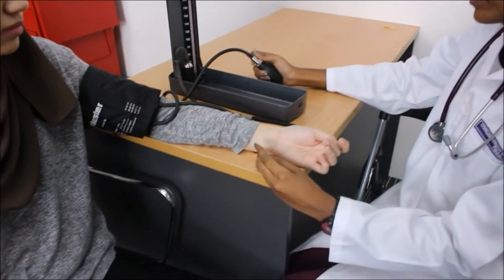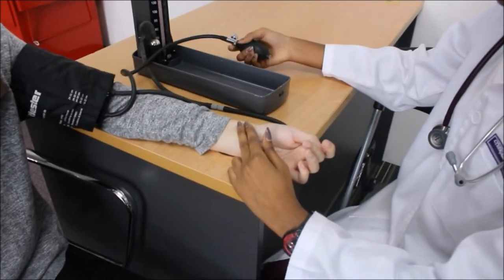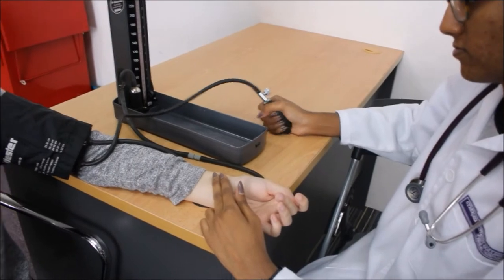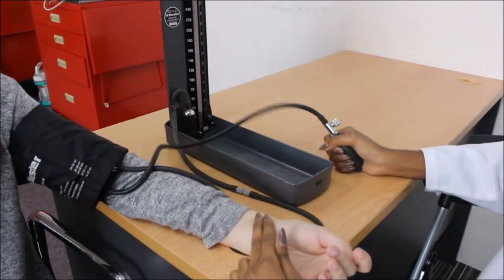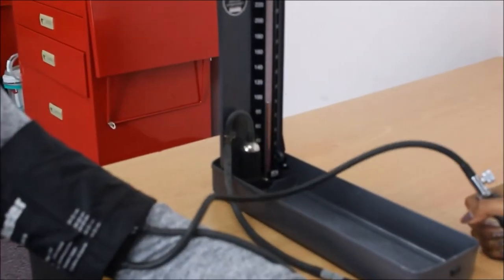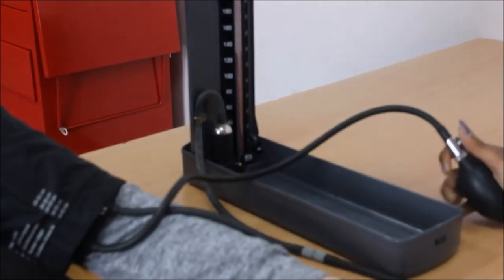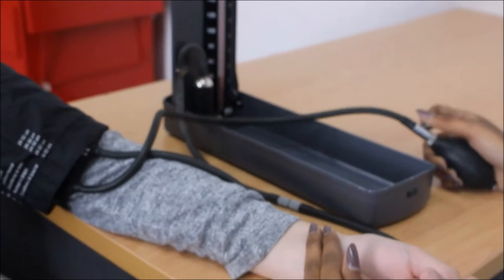After wrapping the cuff around the patient's arm, obtain the patient's radial pulse while simultaneously inflating the cuff. When the doctor stops feeling the radial pulse, deflate the cuff and obtain the initial reading.